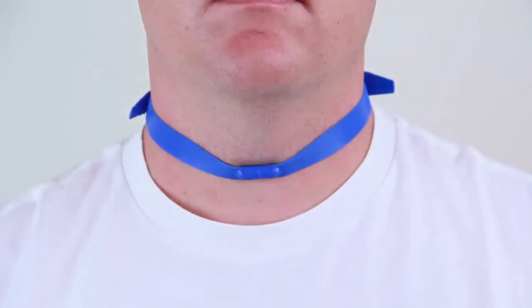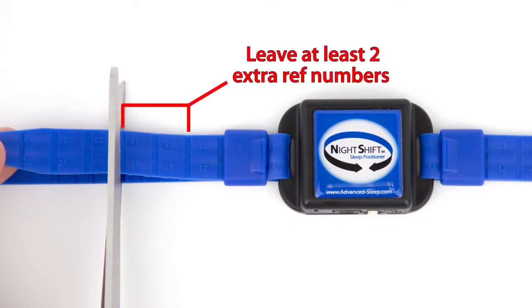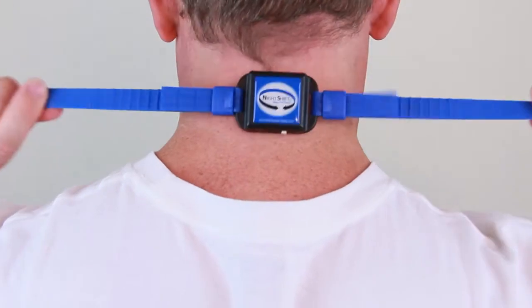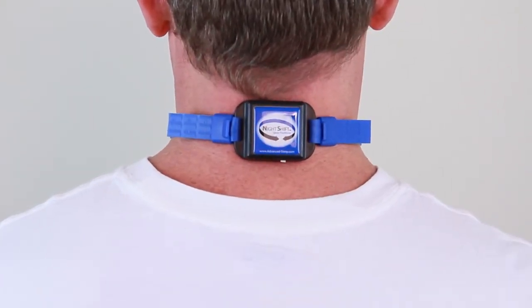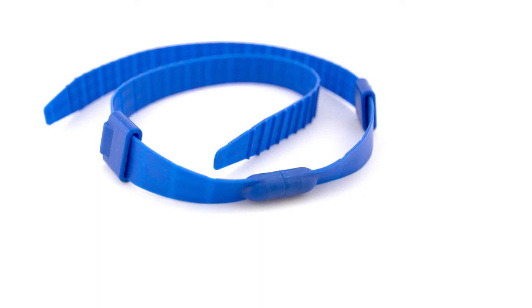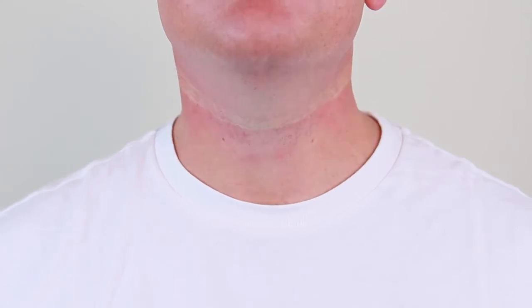Once you are satisfied with the fit, you can trim the excess length off of the ends of the strap. Leave at least two extra reference numbers in case you need to loosen the strap later. With the ends properly trimmed, the Night Shift is now custom fit. Remember to replace the strap immediately if the clasps become demagnetized and do not retain during the night.